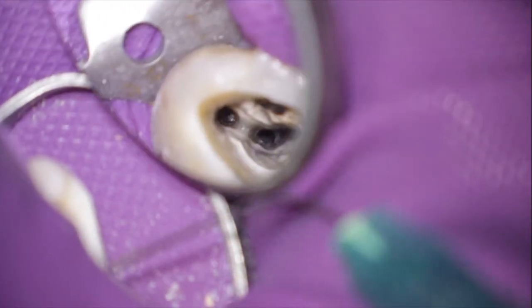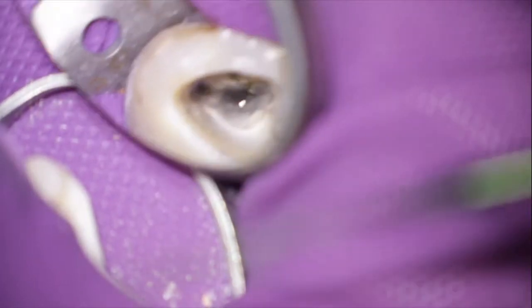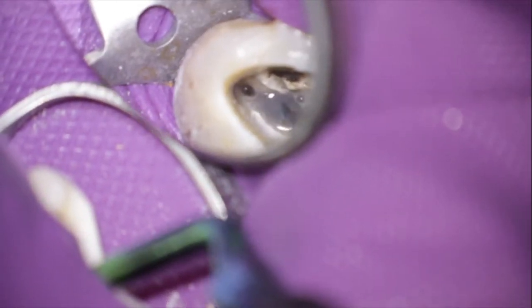You can use the power of ultrasound to create a fluid movement that is strong enough to float the file fragment out of the canal. So I flooded the canals with sodium hypochlorite and gave power to the ultrasonic tip. And now watch what happened. The fragment came out easily. It was pushed out because of the pressure that was caused by the ultrasonic power.